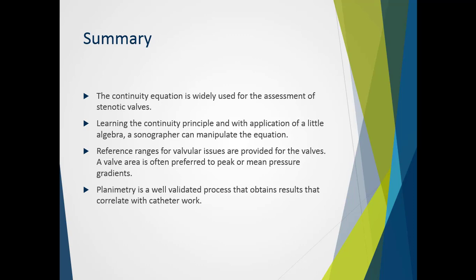The reference ranges for valvular disease are provided for the valves, and an area is often preferred to a peak or mean pressure gradient, as these are dependent on the LV driving them, such as poor ejection fractions leading to lower than expected gradients. Planimetry is a well-validated process that obtains results that correlate well with catheter work.